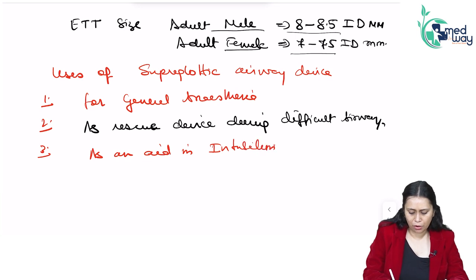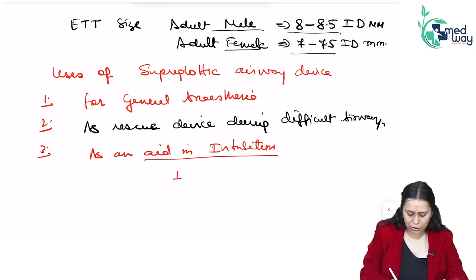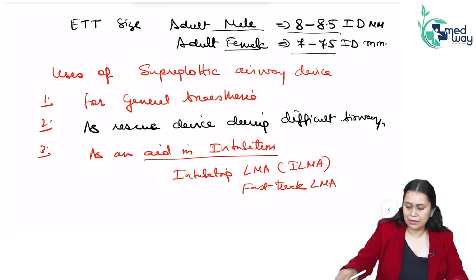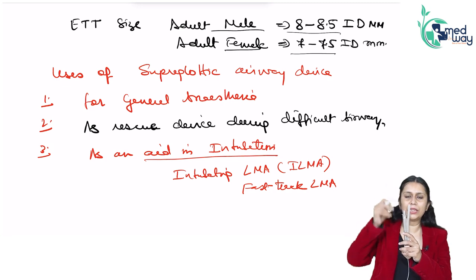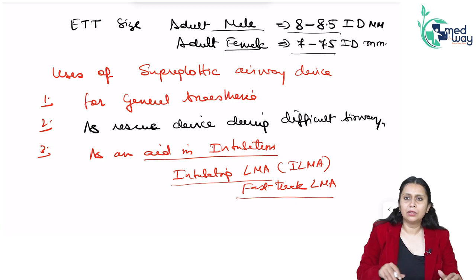So its work area has increased with different kinds of LMA available. These are the different uses of supraglottic airway devices.